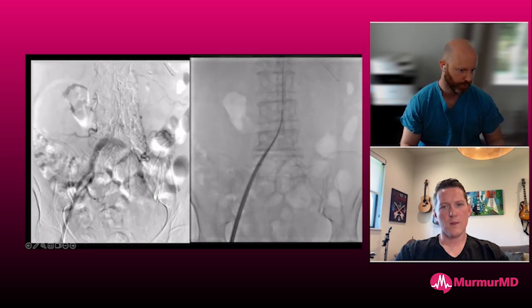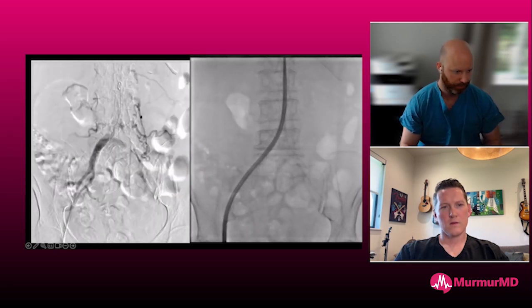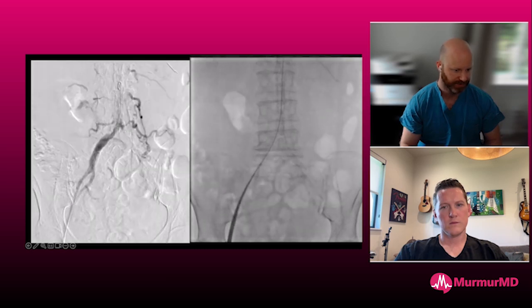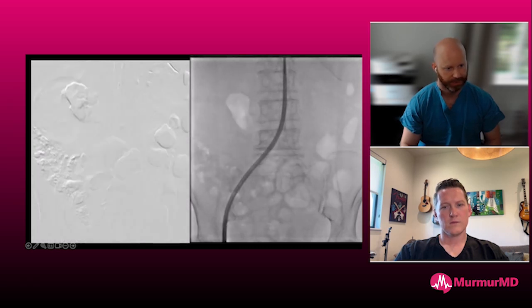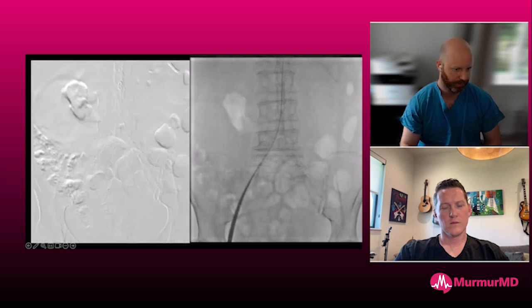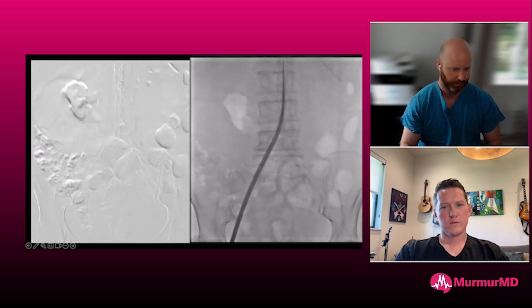If you put the short one here and you're short of the bifurcation and you've revascularized it, the Impella itself isn't exactly smooth. There's lots of little parts to it, and those could get hung up on things, especially in revascularized territories. And I don't really want that. So we want a smooth pathway for the Impella up into the abdominal aorta, and then we can deliver through the abdominal aorta, which is adequately sized, even though in this angiogram you can see it's got clear atheroma pretty much everywhere.